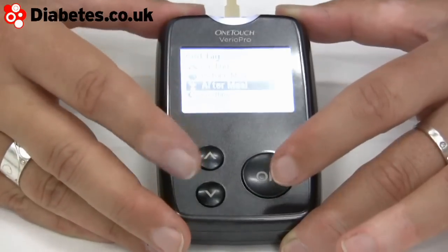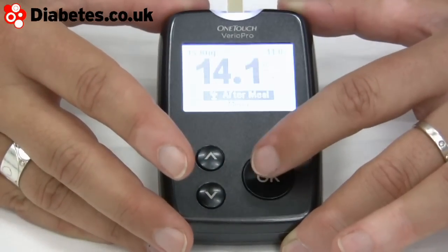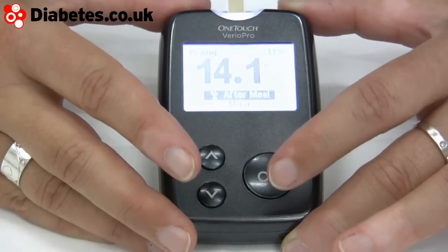And there we have the blood test result. You can add tags — it asks you immediately if you want to add a tag. So you can say is it before meal or after meal. This is actually after a meal, so I'll go down, press okay, and then just leave it.